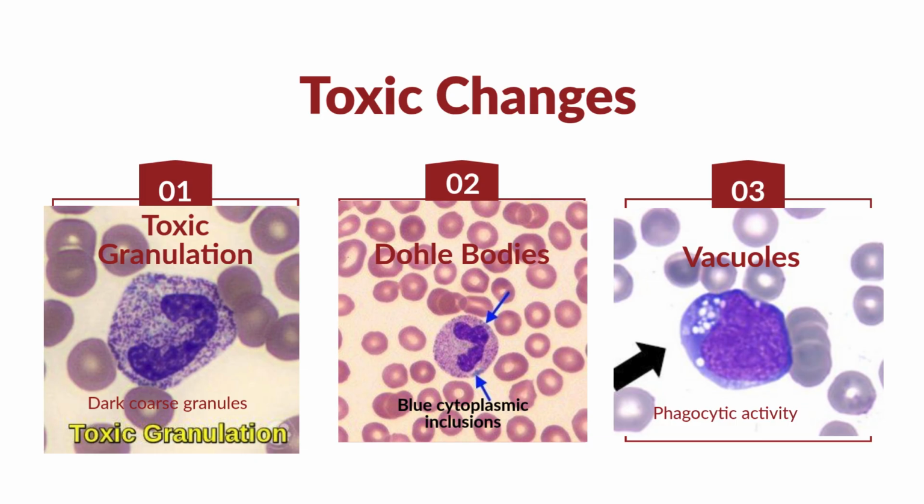Vacuoles mean that there's severe infection, sepsis, or some type of toxic state. Always remember, old blood specimens can also create artificial vacuoles as well. Toxic changes versus blast. So this is why I put this here too.